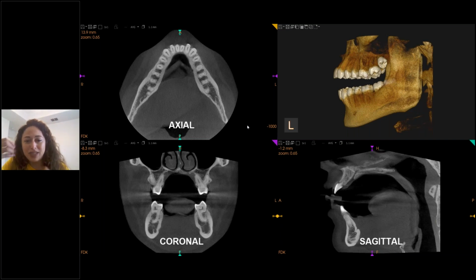And there's a sense of satisfaction when we find something on CBCT scan, between us being happy that we found something, having limited time, limited energy, and a lazy brain. It's very easy to just stop there, to find something and stop there.